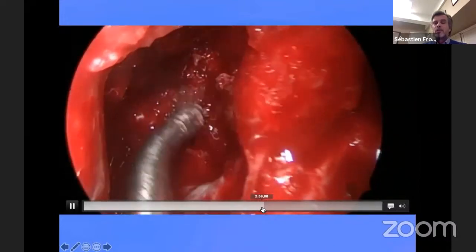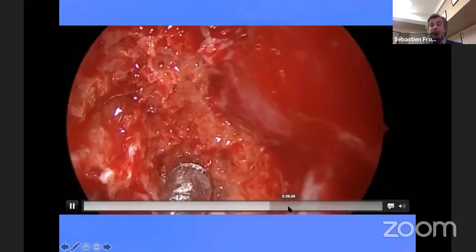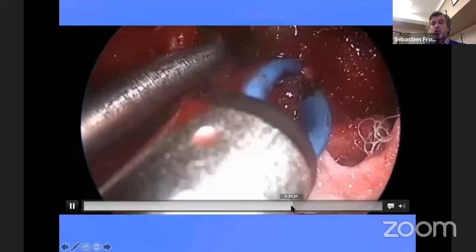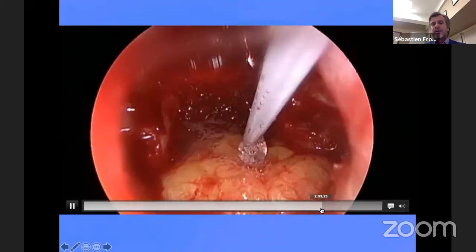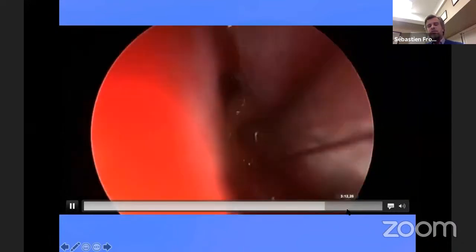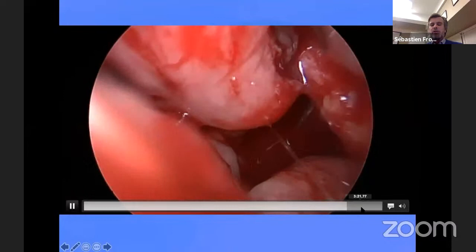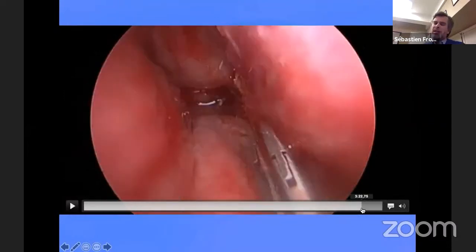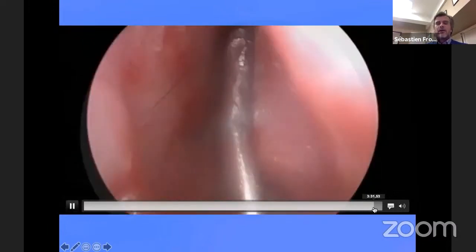You really need to have an angled endoscope to look around corners, but this is the true meaning of the endoscope, to go around and to look around the corner. So you need specific instruments. And at the end, fat into the cavity and stitching the same as before. The patient is very satisfied. The morbidity of the approach is not zero, but it's extremely limited.